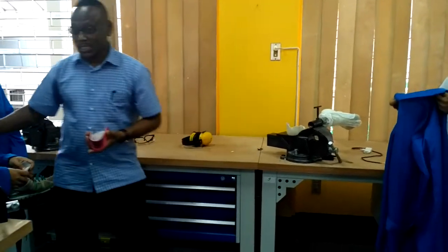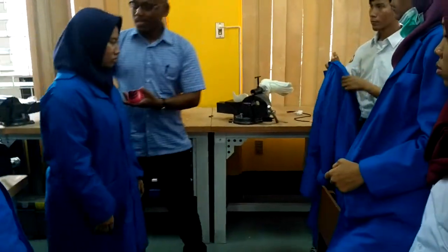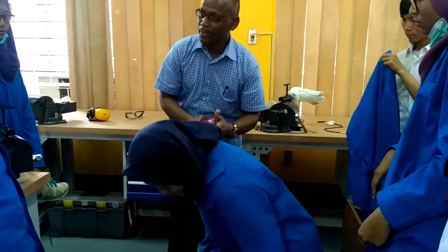So in the room, this is my patient. I am going to come in with my thesis cover together. Here, before I say good morning to the examiner, I will start with this. That's the patient here.